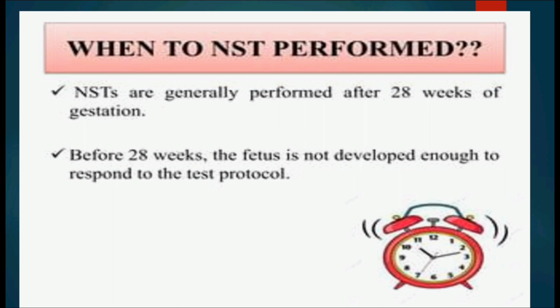Now, when to perform NST or non-stress test? NST is generally performed after 28 weeks of gestation. Before the 28th week of gestation, the fetus is not developed enough to respond to that test protocol. So we do an NST after the 28th week of gestation.